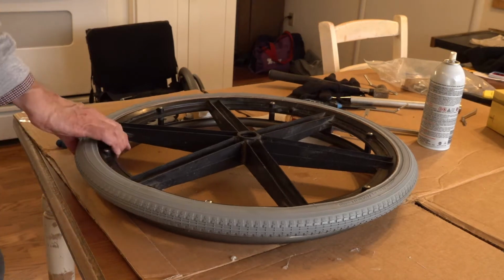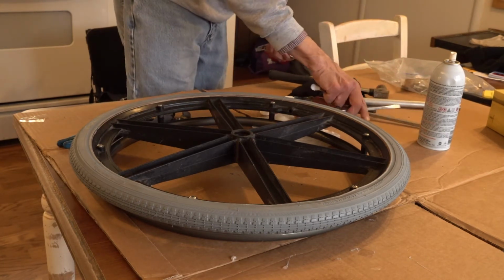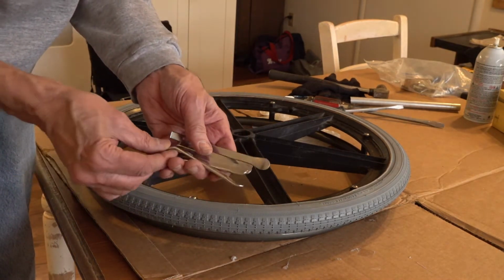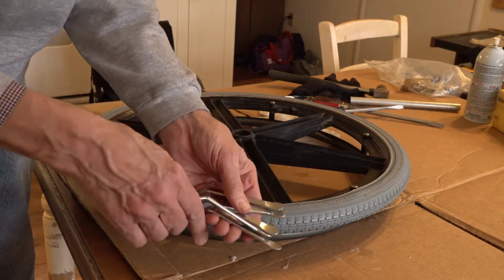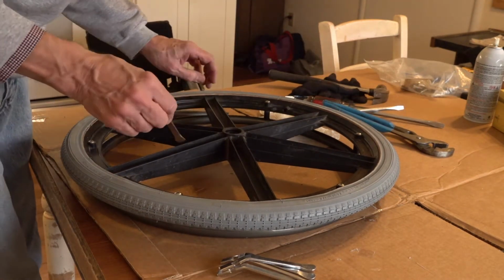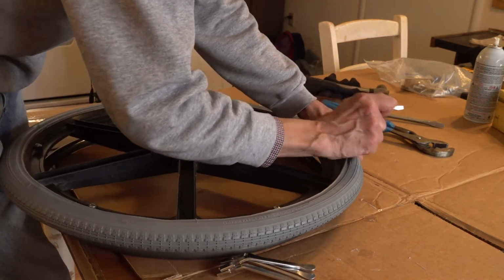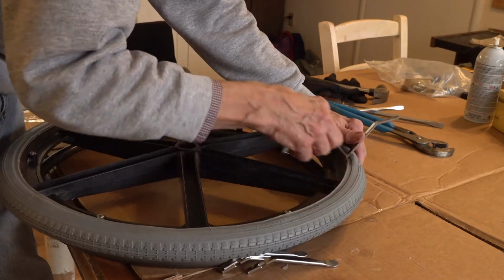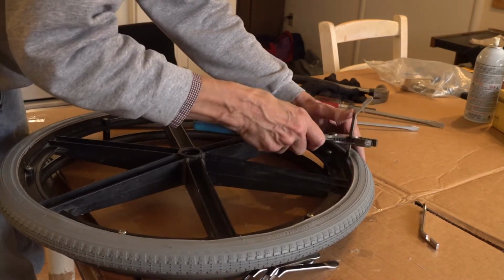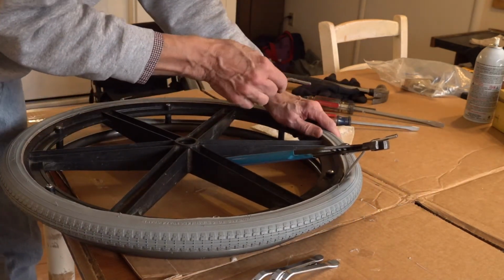Now comes the hard part. For that, I use some standard bicycle tire tools. They're called spoons in the trade, I believe. And I have a little cheater bar here to help. Okay, I'm going to put the first one in. I'm going to hold that in place, so I'm just going to jam the tool here against it. Okay, so that's going to stay put. I don't have three hands, so that's going to be my third hand.